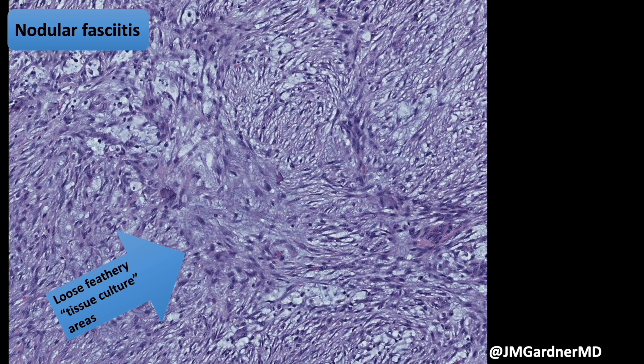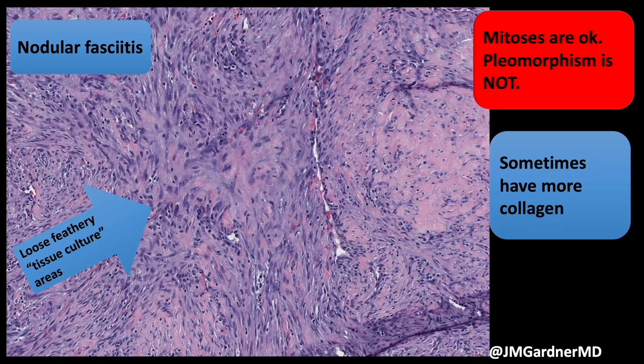Here's the so-called tissue culture pattern — a term that doesn't really have meaning to me outside of nodular fasciitis, since I've never grown fibroblasts in a tissue culture dish. The terms I prefer to describe these areas are 'loose and feathery,' but some people call them tissue culture. Whatever visual cue works for you, go for it.